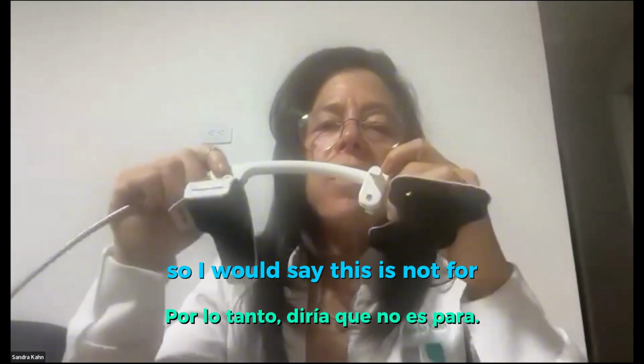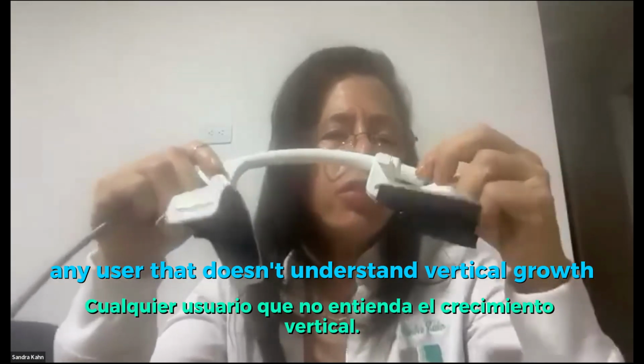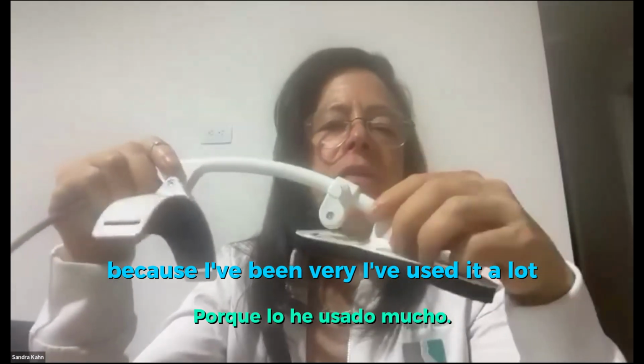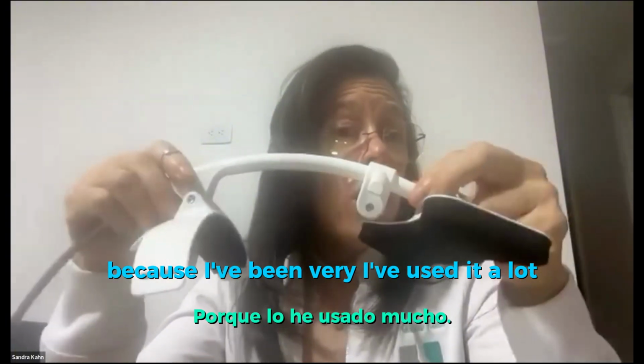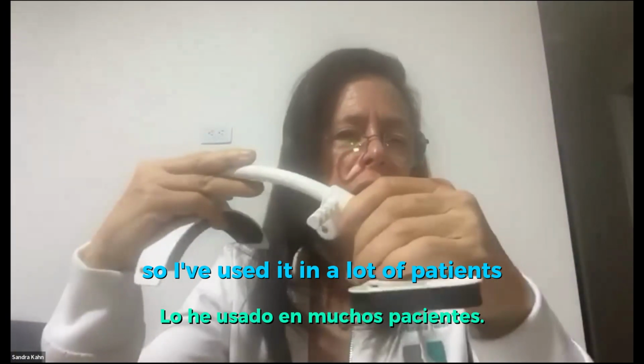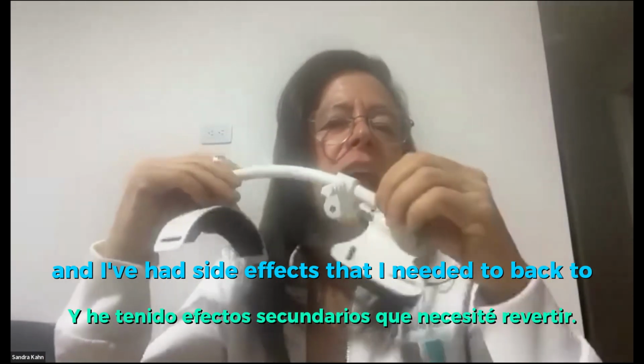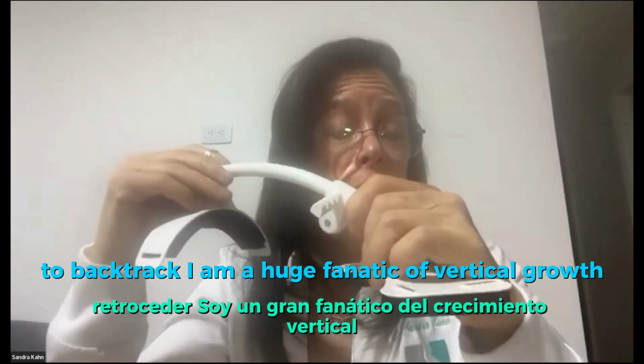So I would say this is not for any user that doesn't understand vertical growth, because I've used it a lot. I've had this for about 12 years now. So I've used it in a lot of patients, and not every patient has been successful. And I've had side effects that I needed to backtrack.